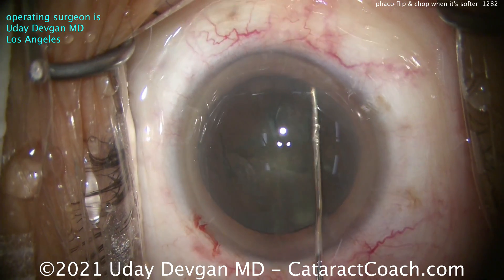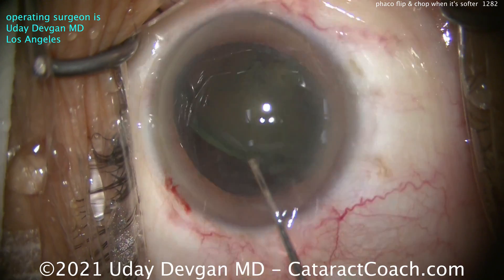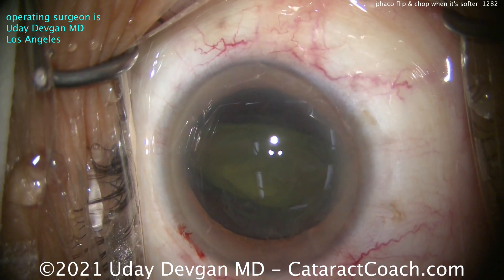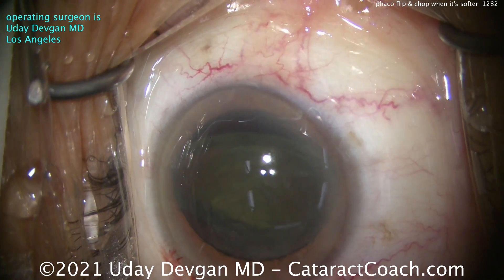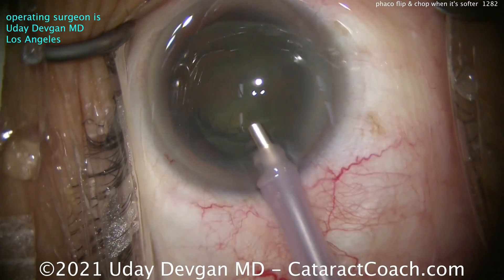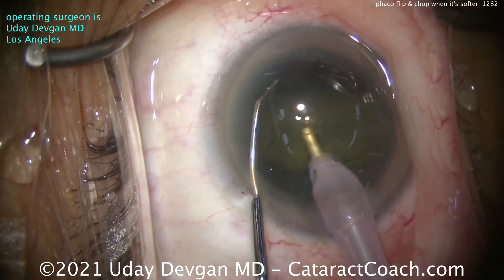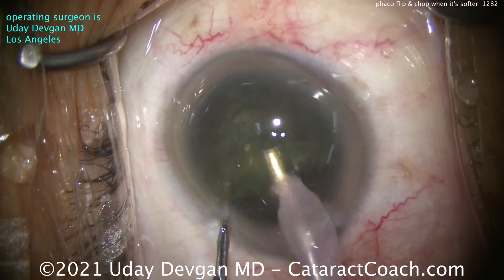It's not forceful — very soft pressure, but consistent. As the nucleus comes up, use that cannula to get it flipped over. Now the nucleus is standing up on its side. A little more dispersive viscoelastic right there in the center, just a little. Same settings as before: 40cc per minute of flow, about 400 to 500 millimeters of mercury of vacuum. The key here is getting that nucleus in front of the phaco tip — it's not dense at all.